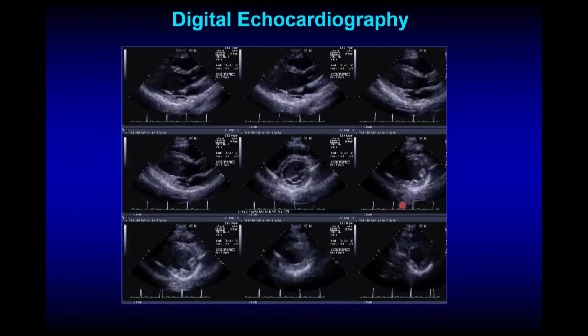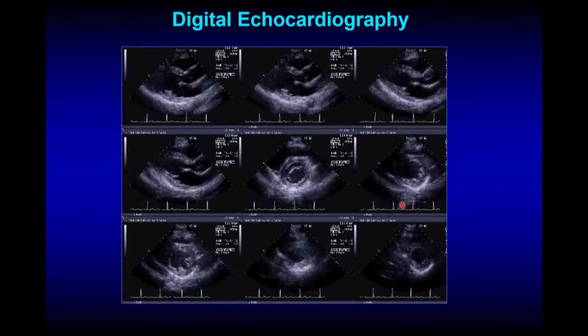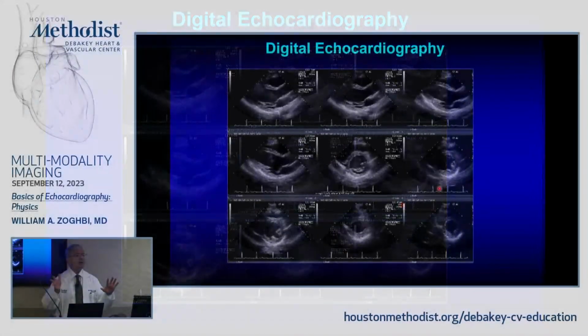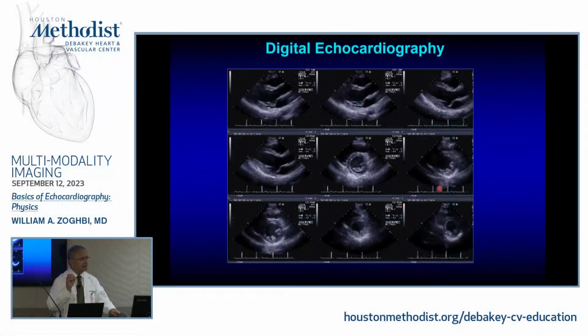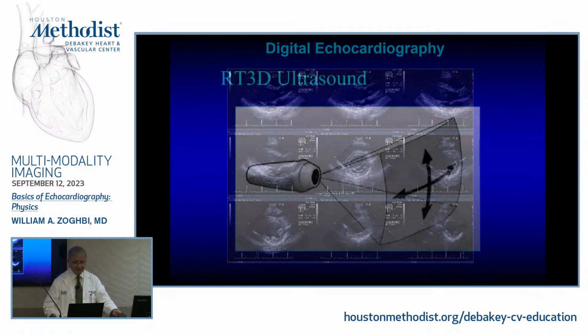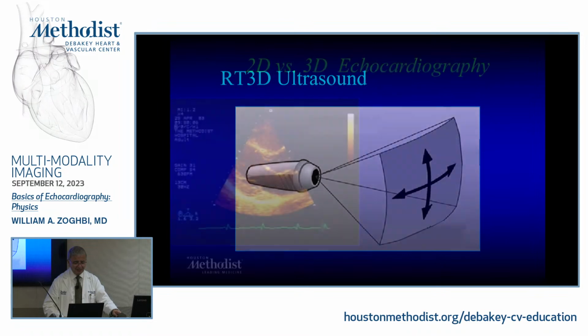I usually read on a 9. You guys read on a 4 or whatever. It doesn't matter as long as you look at the whole study and pick the areas that are emphasizing ventricle, atria, RV function, whatever it is. And I think that's the beauty of it, as opposed to the early days of video where you just can't blink and you keep going and going and going.